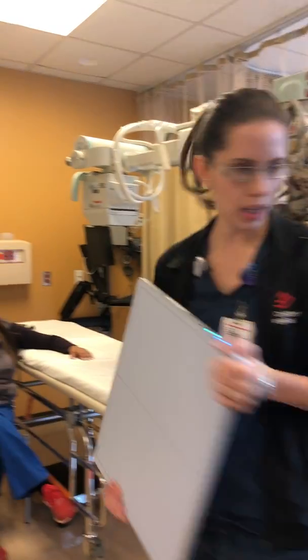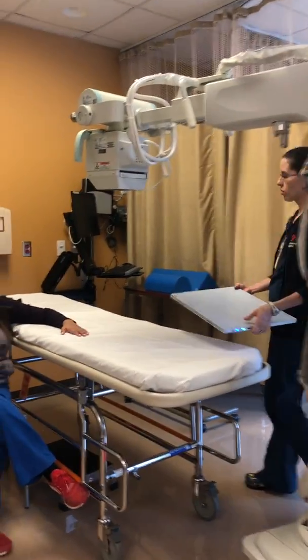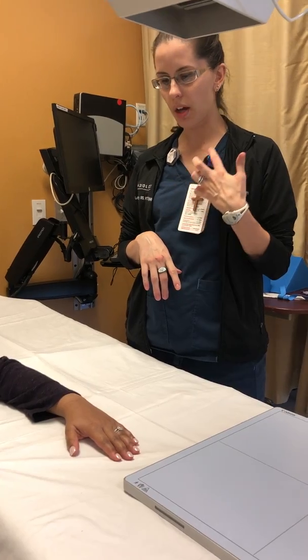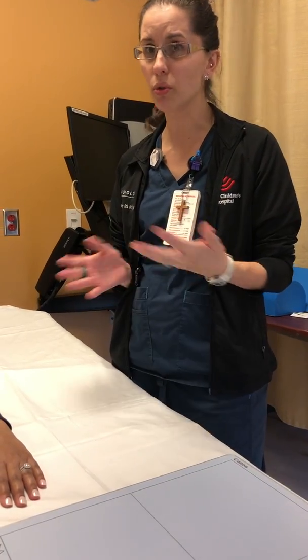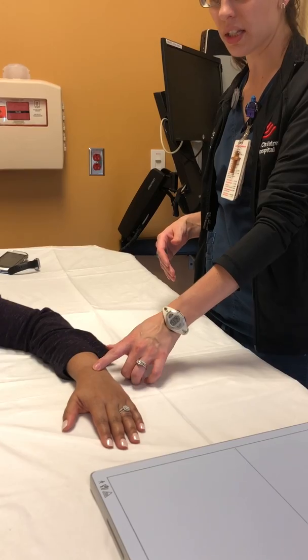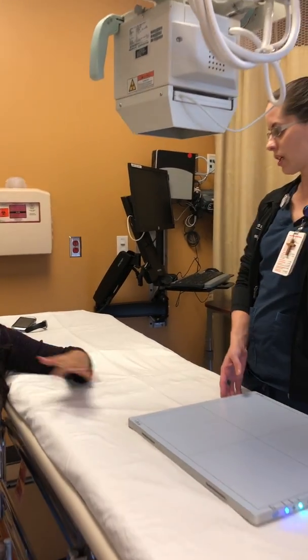So again, we have our patient over here. Hello, Miss Annie. This is a great example of older teens or children with bracelets and things. Lots of people come in with jewelry, which is beautiful, it's great, but we don't want it on our image. So always make sure to be mindful of taking off watches, bracelets, rings, that sort of thing. So if I could have you take off your jewelry for me, please.